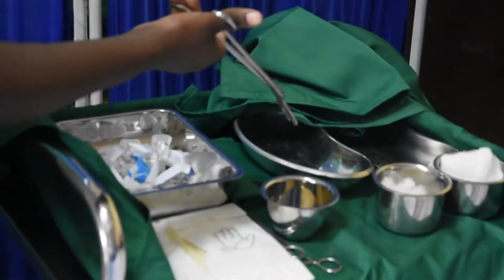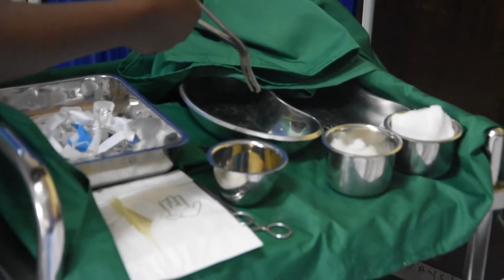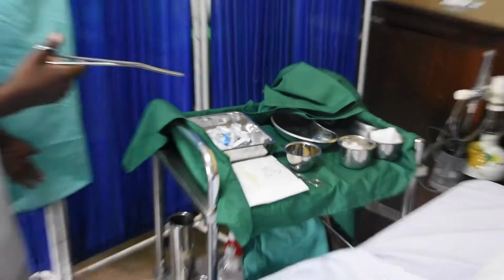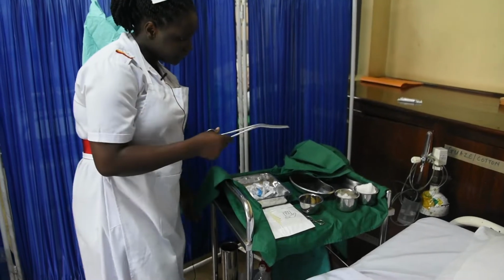We shall need 2 different receivers, one for the used swabs and gauze, then the other one for the used trachea tube.